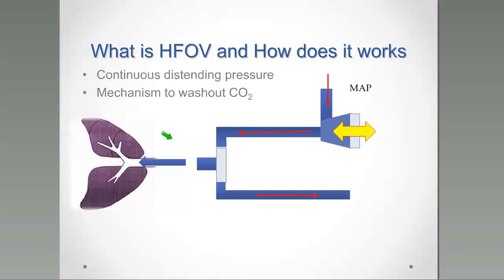In this tubing system, we have an air chamber where there is some area that is going to move forward and back by a piston or membrane or a valve with a force, what is called delta P, that is going to compress the gas in this chamber, and this compressed gas is going to transmit energy.